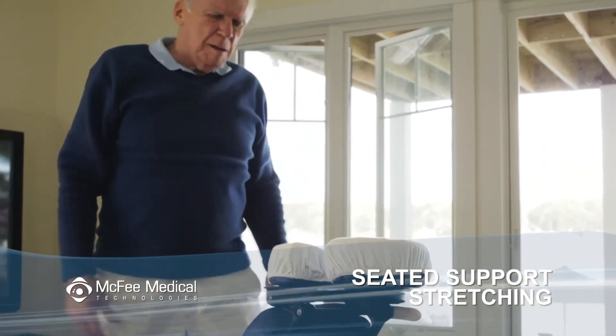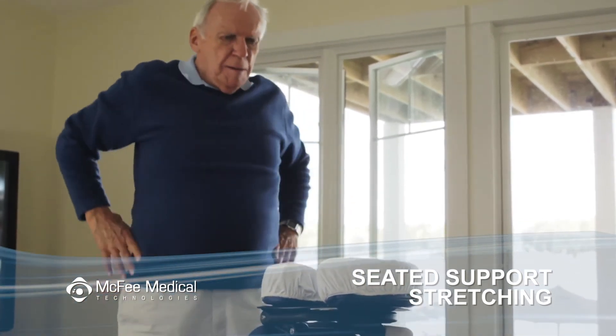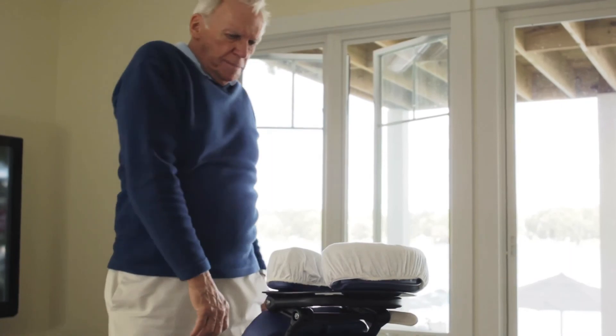After a while, your position may no longer feel comfortable. For muscle relief, it is recommended you get up at least once an hour to stretch and move around.